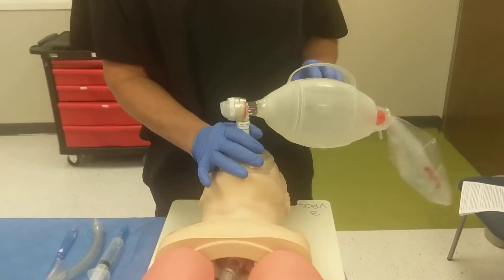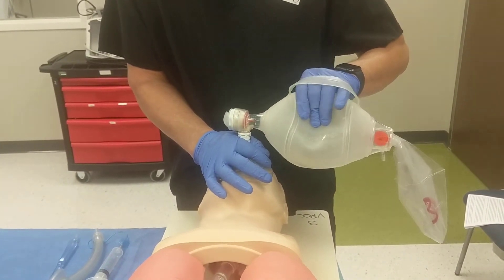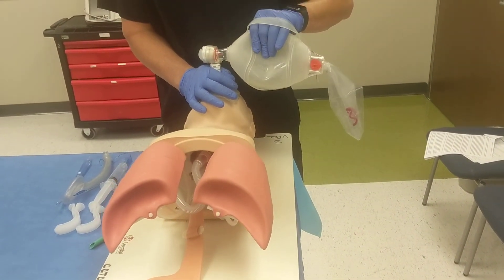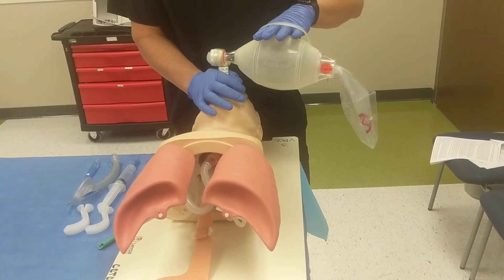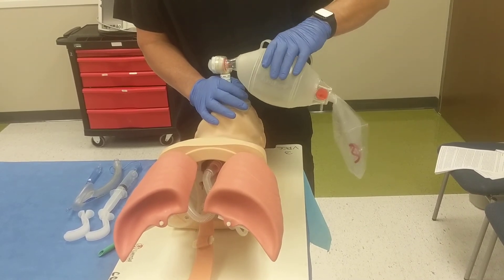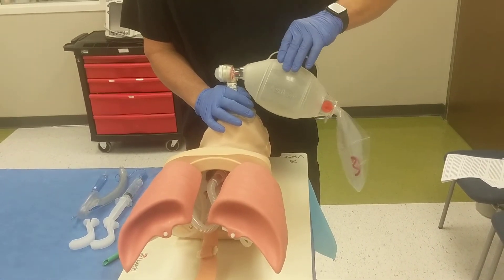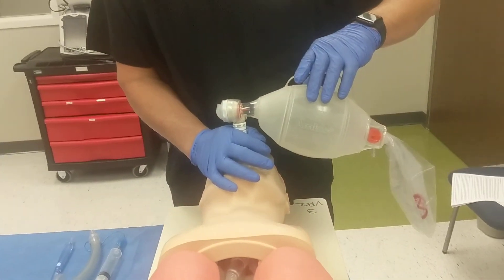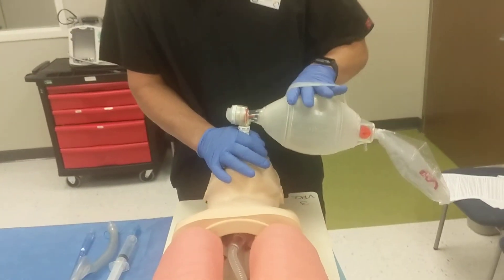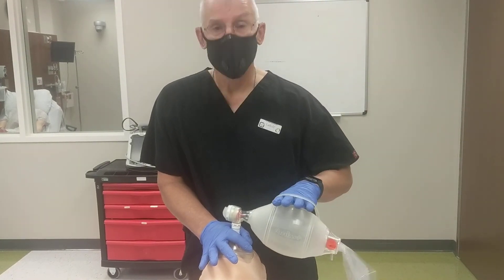One last thing: make sure you use the holster if you're by yourself or in charge of ventilations. One gentle squeeze — it's not a rapid squeeze, it's a gentle squeeze. Allow the bag to fully reinflate. If you do not use the holster and allow the bag to reinflate freely, you will progressively lose control of the bag. Your fingers will work their way up, particularly if you're nervous or sweaty, and now you're delivering much less tidal volume and having trouble holding on to the bag. So use the holster — that's what it's there for. That is basic bag valve mask ventilation. Thank you.